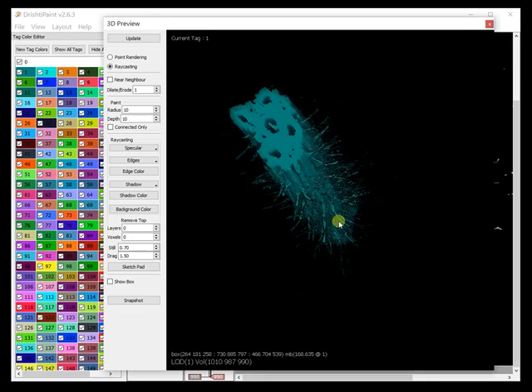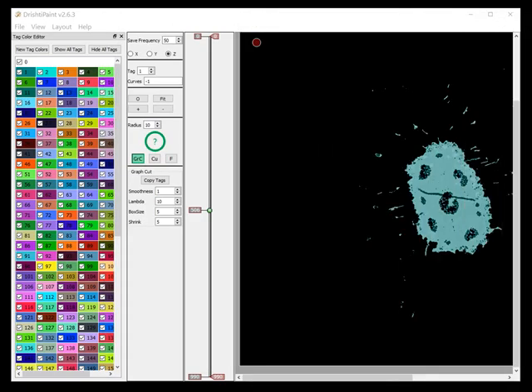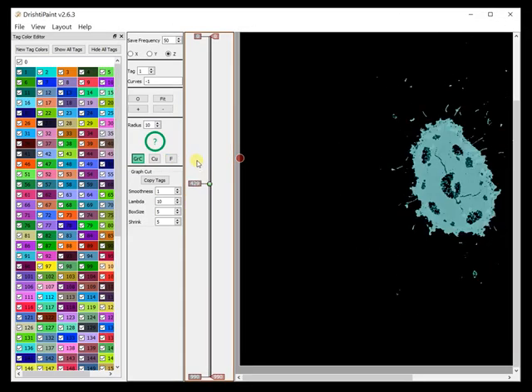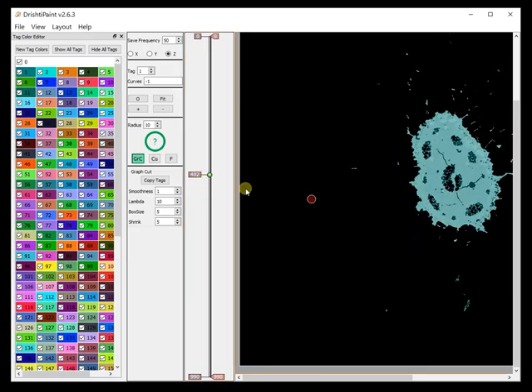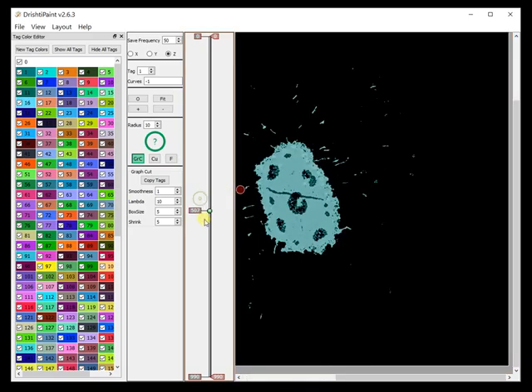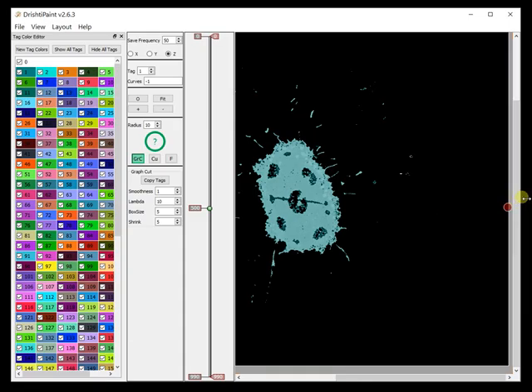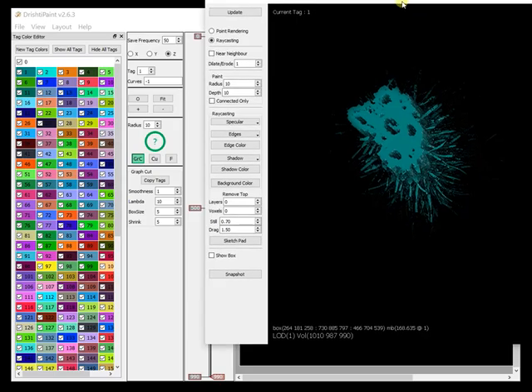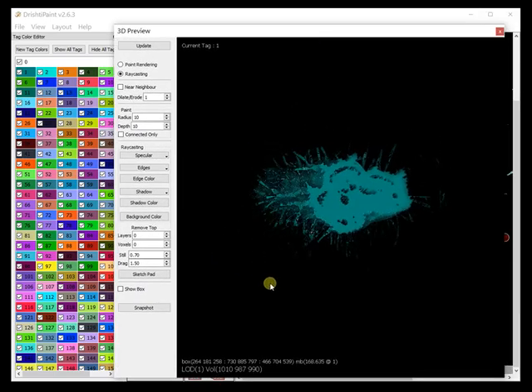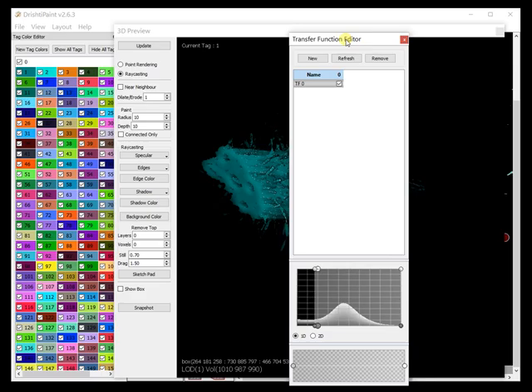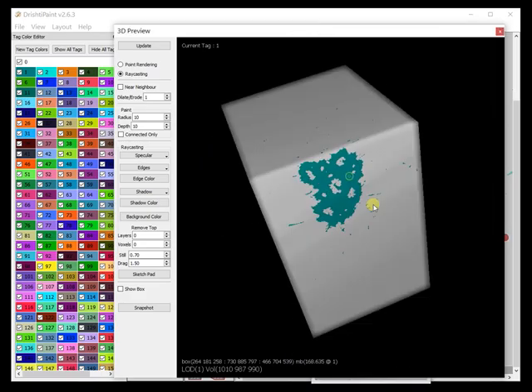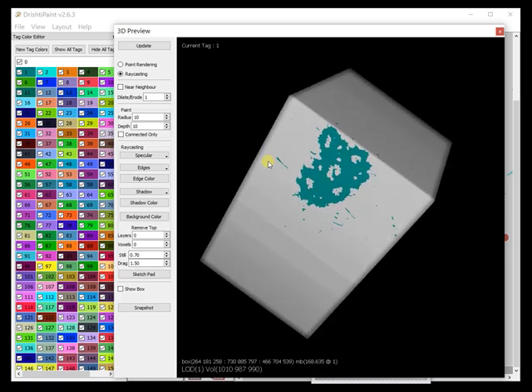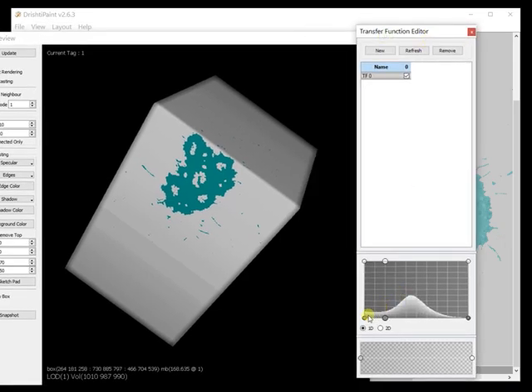This has been tagged here and if you go to the slice view there are still regions that are not tagged. Maybe we should just apply for a bigger covering. If I change the transfer function here then we can see that these holes are not filled up. Let's fill up those holes. I'll change back the transfer function.